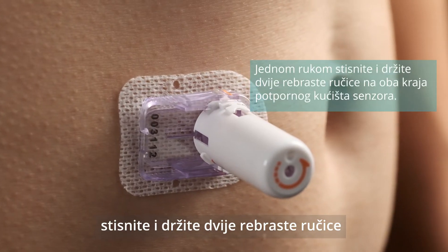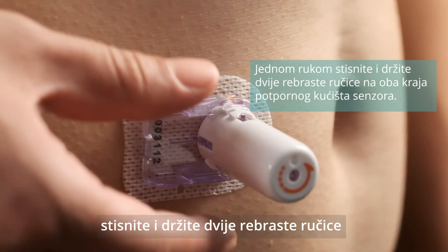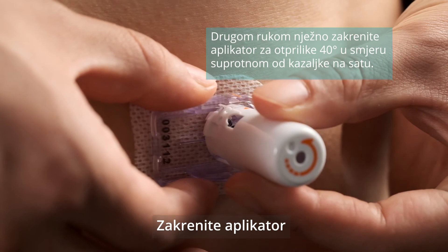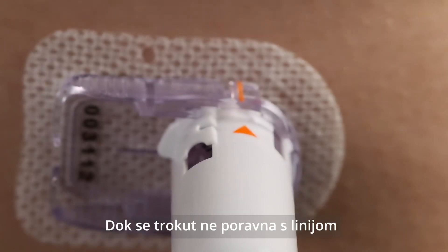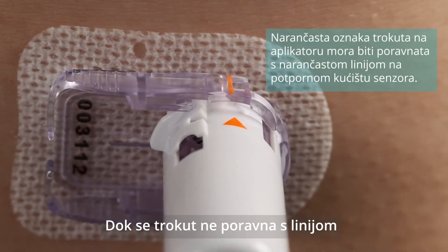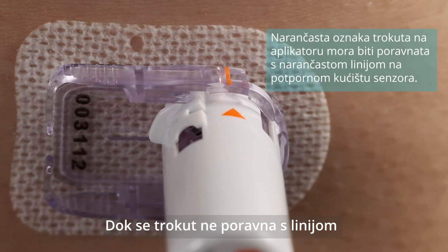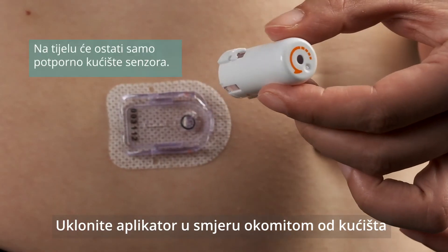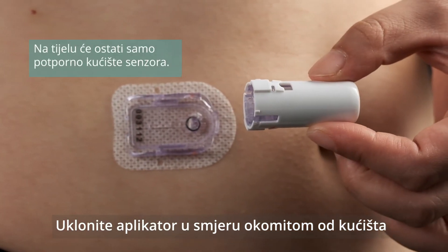Pinch and hold the two ribbed release tabs on both sides of the sensor support mount with one hand. Gently rotate the inserter about 40 degrees counter-clockwise with the other hand. The orange triangle mark on the inserter should line up with the orange line on the sensor support mount. Remove the inserter perpendicularly. Only the sensor support mount will be left on your body.